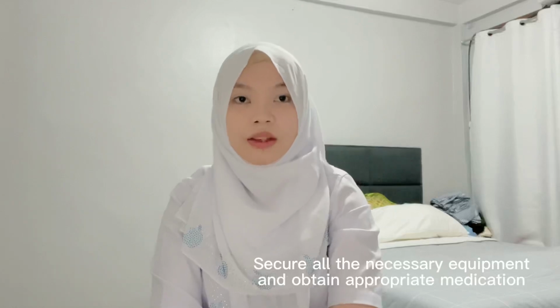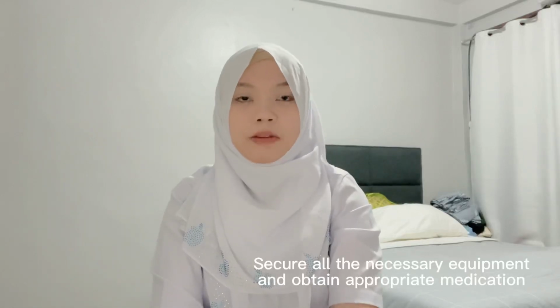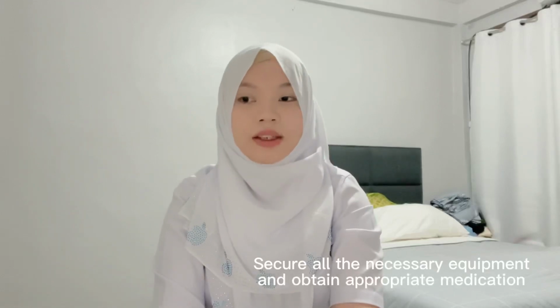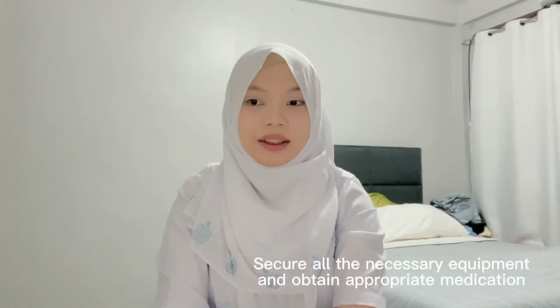Next is to check each medication card against the physician's order. Then secure all the necessary equipment and obtain the appropriate medication. Prepare the medication in the medication section for one patient at a time.